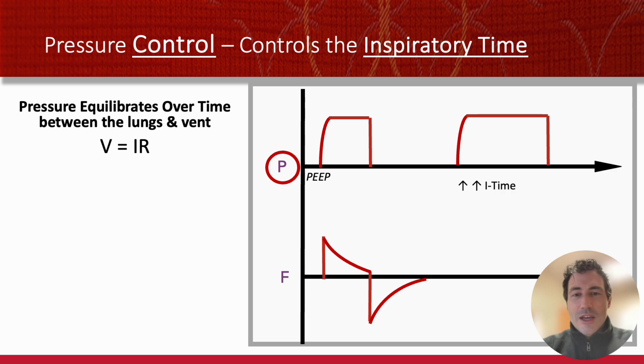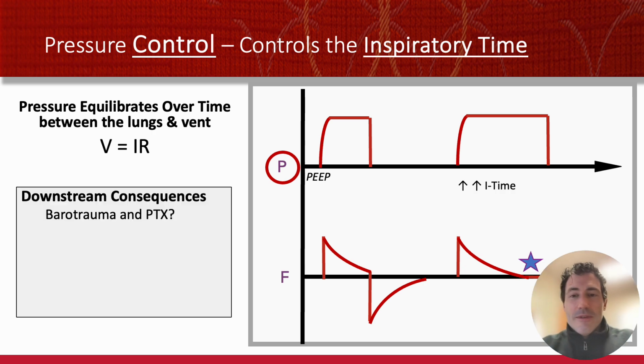Of course not. But as you notice, your flow keeps going down, and eventually the pressure of the ventilator pushing air in equals the pressure of the lung pushing air out. And what happens when you have a really long inspiratory time is you've given the lung enough time to equilibrate. It will sound like this. And then the pressure in my lung equals the pressure of the vent. And you sit there. That's called an inspiratory pause.